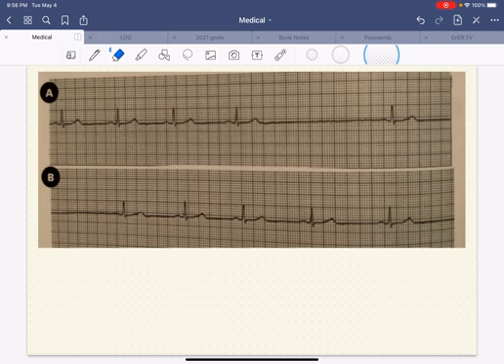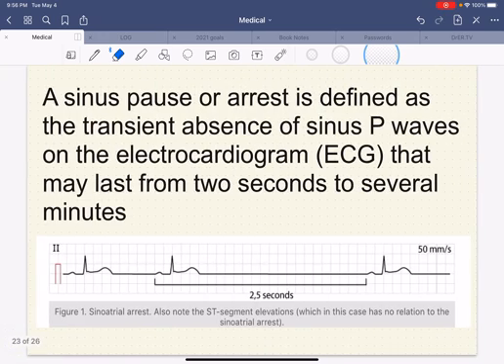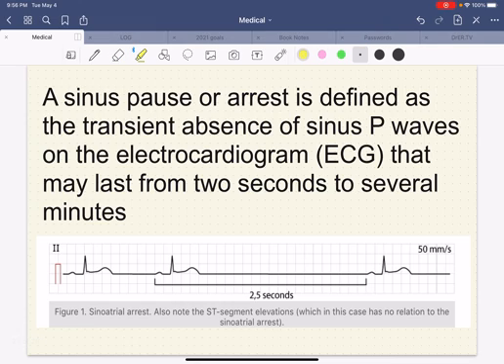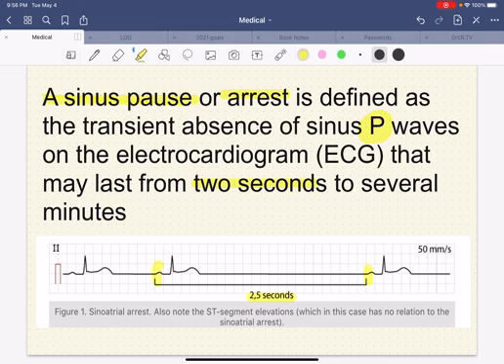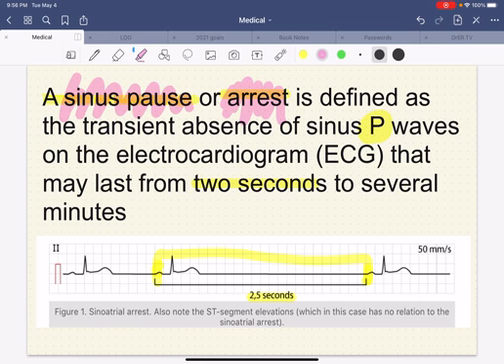So we're going to talk about this issue — what it is, what it means, how it's defined. This is called a sinus pause or sinus arrest, defined as the transient absence of sinus P-waves on the EKG that may last two seconds to even several minutes. In this particular case, 2.5 seconds between P to P — so this is called a sinus pause or sinus arrest.